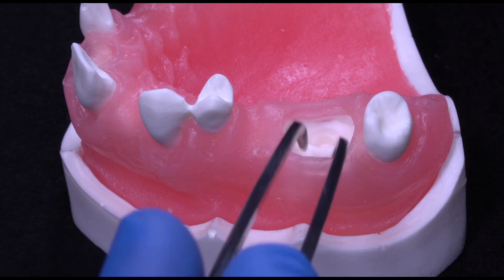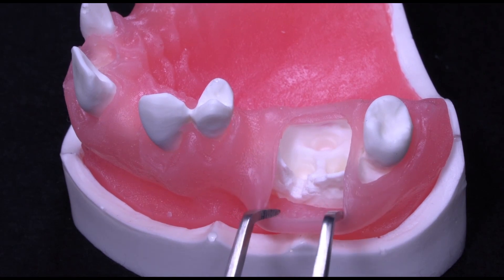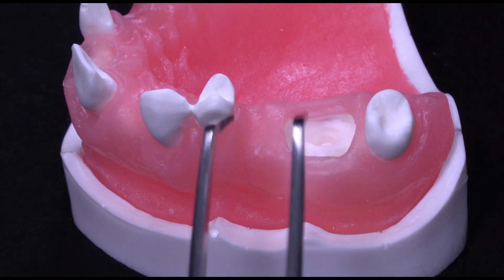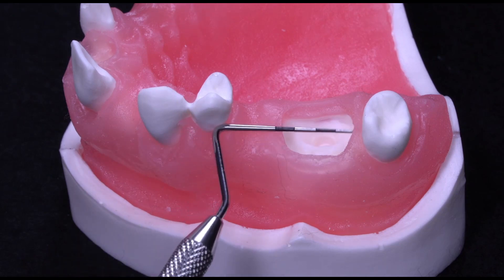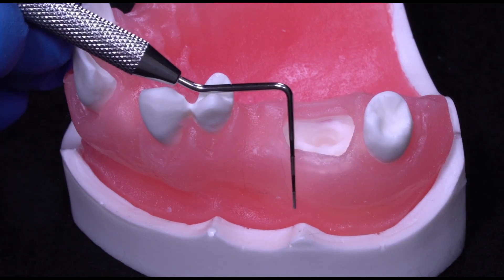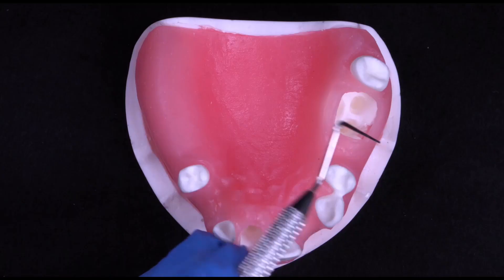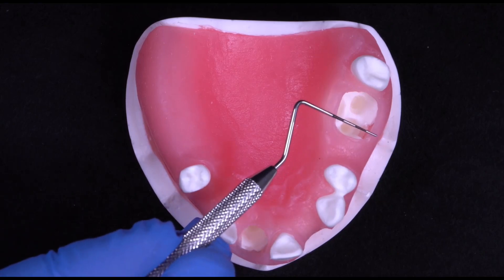In some cases, the buccal alveolar bone is missing and a barrier membrane is needed to prevent soft tissue infiltration into the bone graft material. The mesial distal width as well as the length from the apical boundary to the palatal soft tissue is measured to determine the size of the membrane needed.